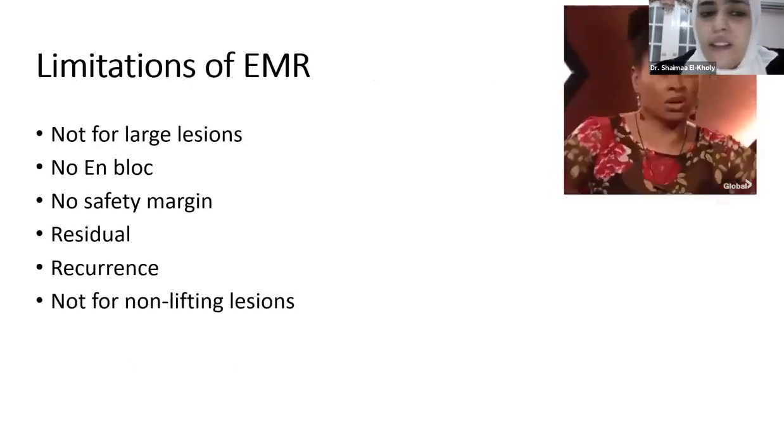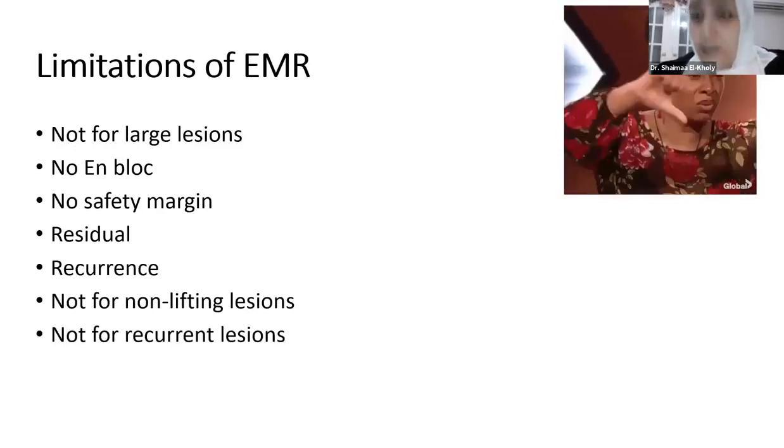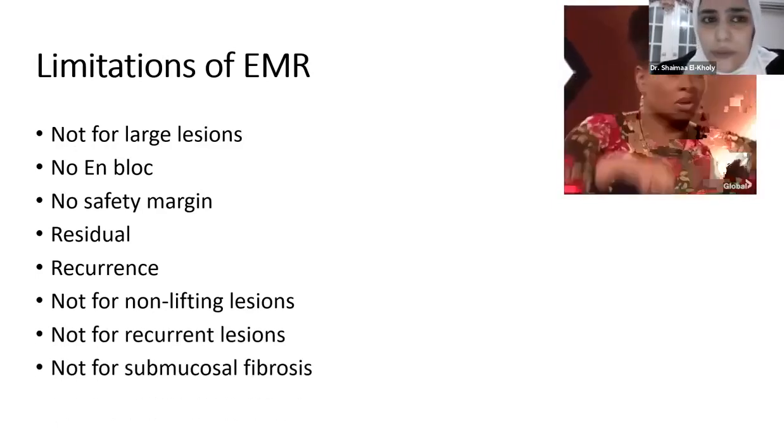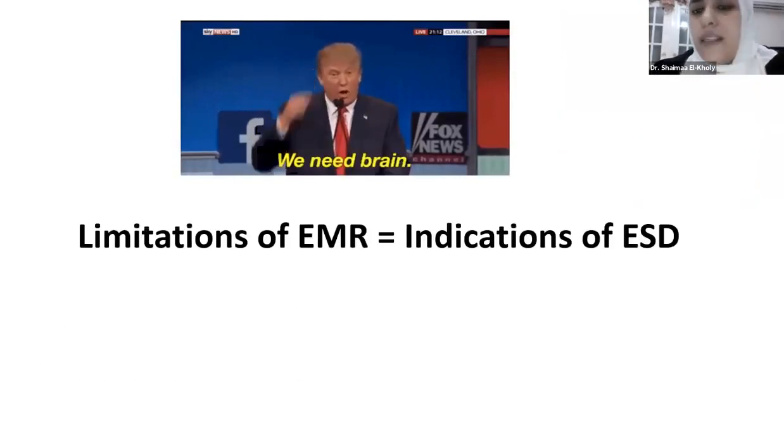And EMR is not suitable for non-lifting lesions, and it's also not suitable for recurrent lesions or any lesions with submucosal fibrosis. So if you just give it a little bit of thinking, of course, not like this guy thinking, the limitations of EMR are the indications for ESD.